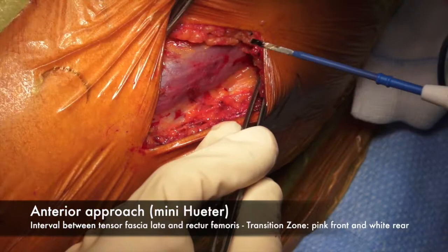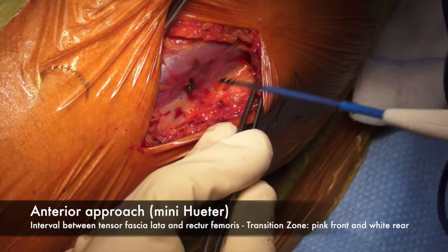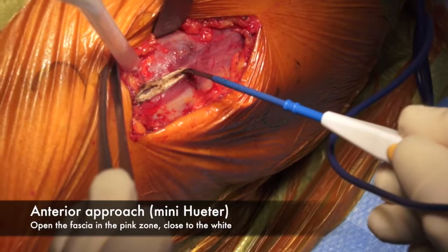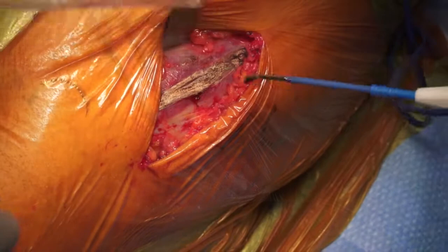1. Interval between tensor fascia lata and rectus femoris. Transition zone, pink front and white rear. 2. Open the fascia in the pink zone, close to the white. 3. Release the muscle from under the fascia.